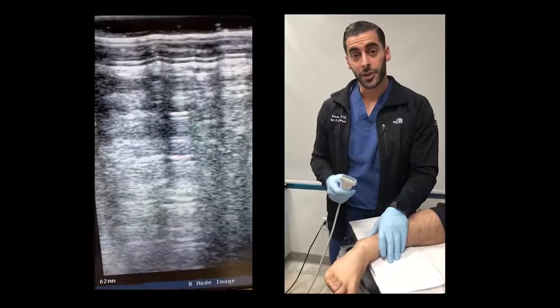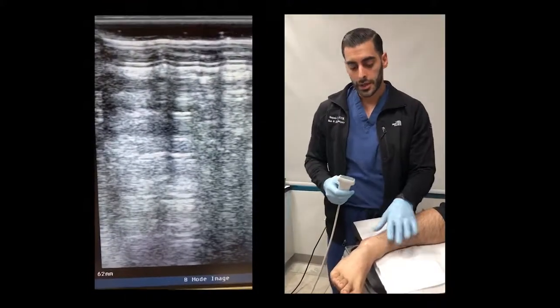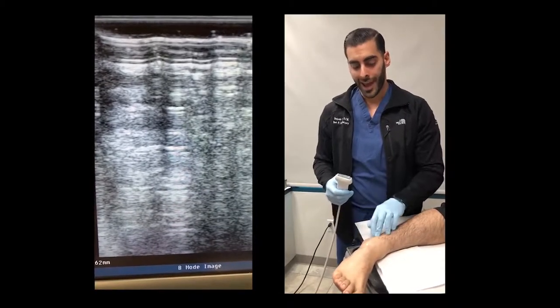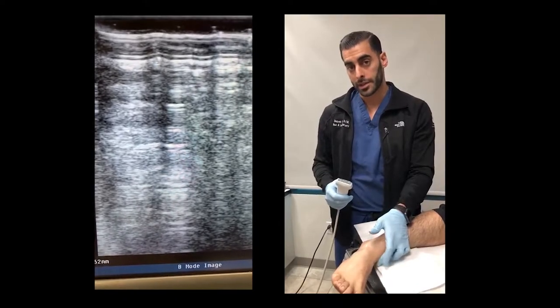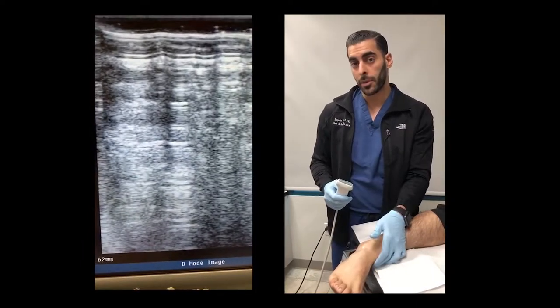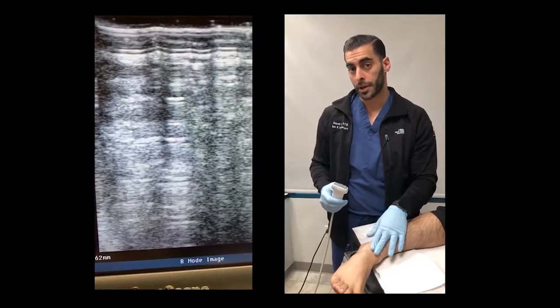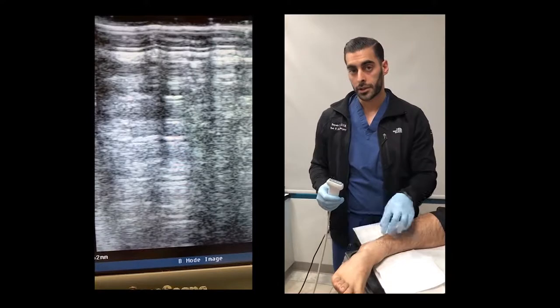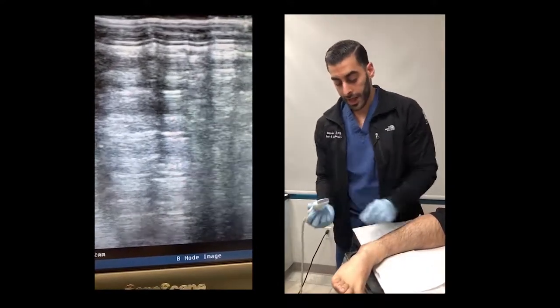All right, now I'm going to show you guys how you can use ultrasound to visualize anatomical structures that surround the ankle. So I'm going to discuss the ATFL, the CFL, the AITFL, the PITFL, as well as one of the deltoid ligaments on the medial side. In another video, I'm going to show you guys the medial compartment with the posterior tibial tendon, as well as a separate video for the anterior compartment with the anterior tibial tendon. But for now, we'll just focus on the surrounding ligaments of the ankle. So we'll start with the ATFL.